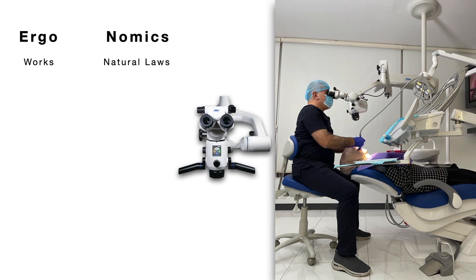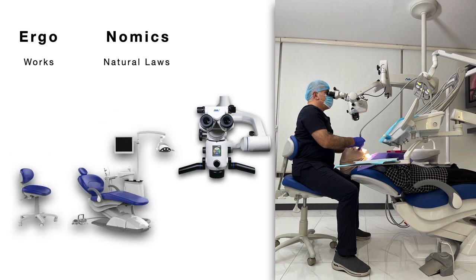fatigue in my muscles. I would also like to motivate you to use not only the dental operating microscope to get relaxed in your work, or to have a scientific posture during the treatment procedure, but also this doctor's stool, which is a new updated one. You see, it bends itself with my neck, or with my back, and with my shoulders, or my posture, to give a very good position. And also the dental chair: you should choose a dental chair which has an ergonomic design. So these two stools and this dental chair have an ergonomic design.